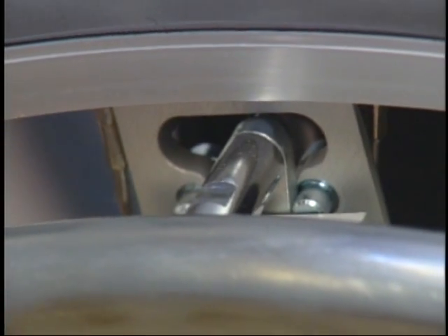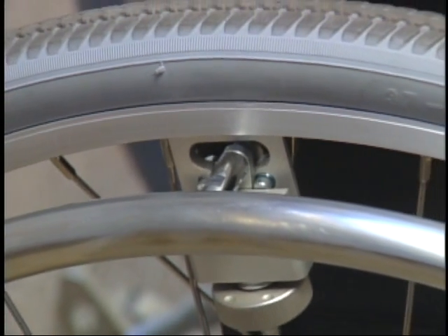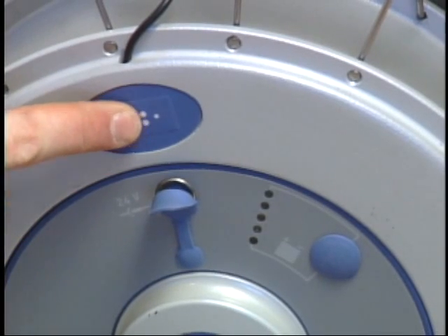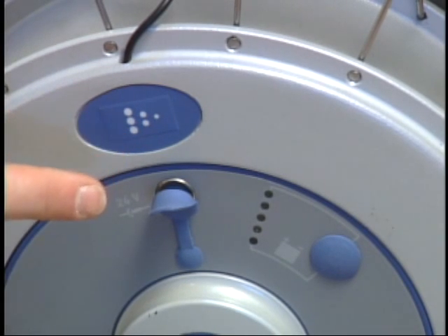Forward and backward motion is controlled by the push rims as the user propels the wheelchair in any direction. Emotion has three power assist levels; simply press the power level button and the amount of assist changes.